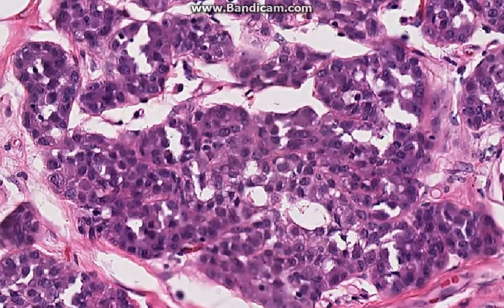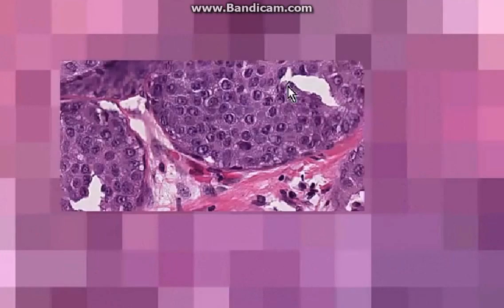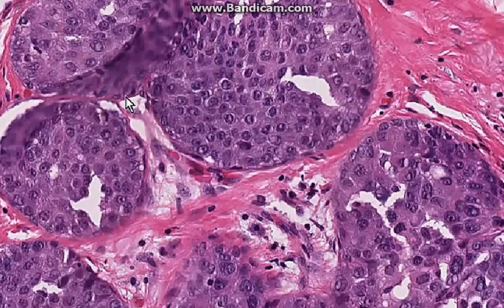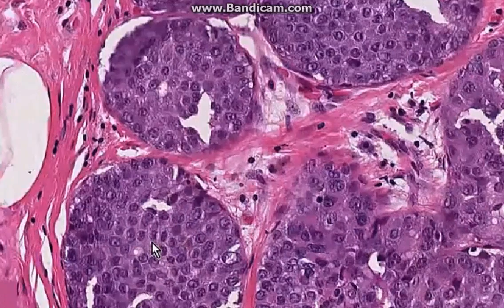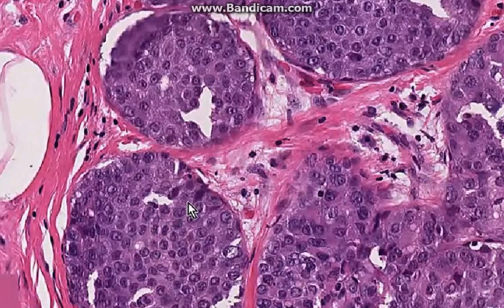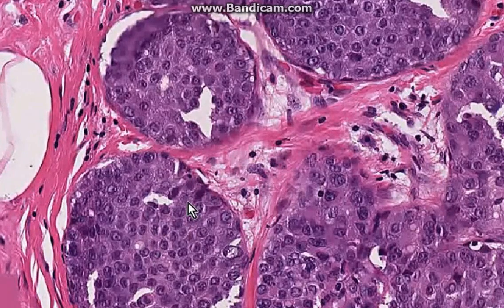Notice that in the acini of lobular carcinoma in situ, there is virtually no lumen and they're just packed with these cells. Here is another lobular carcinoma in situ, and another lobular carcinoma in situ.